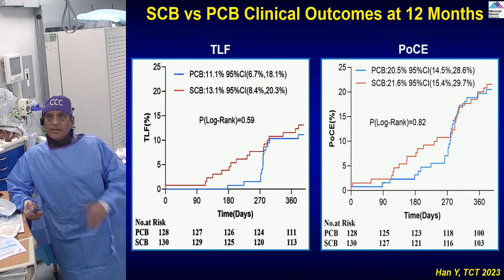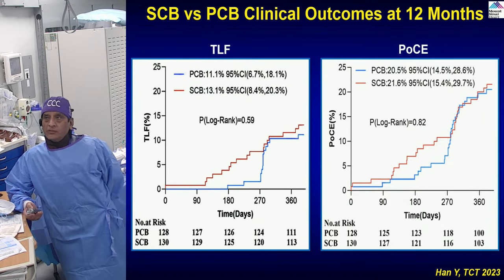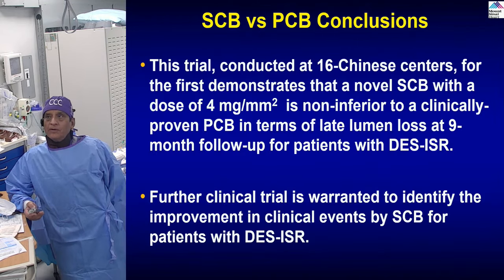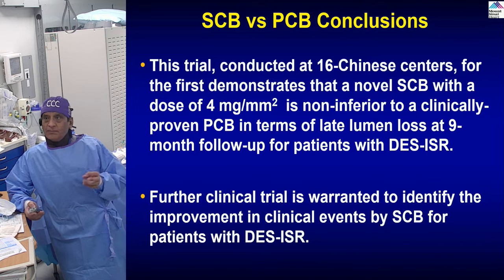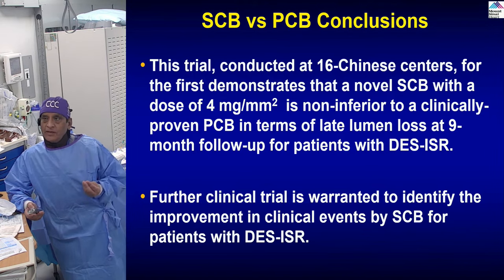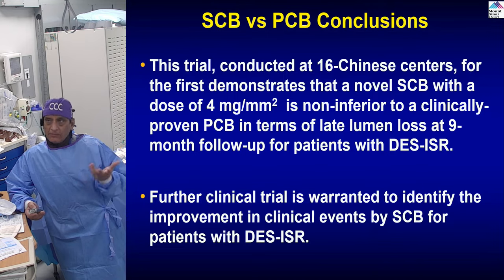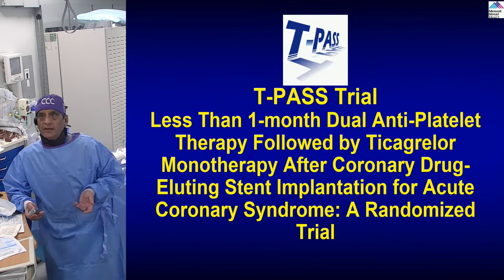So we still need to see what will happen. TLF and the patient-oriented composite endpoint were not different. I would say they probably have to come up with a better combination if it really has to translate into a better, or maybe equal, result. I can tell you the drug-coated balloon IDE trial showed such an effective therapy for ISR that as long as it is equally effective, I think it will be good enough. And that is what we are evaluating, the sirolimus-coated balloon.